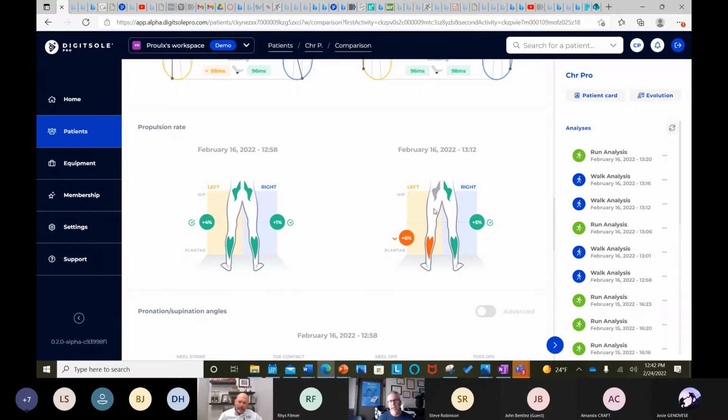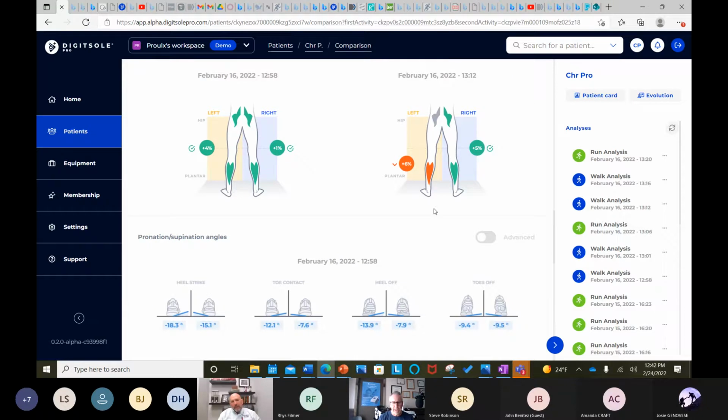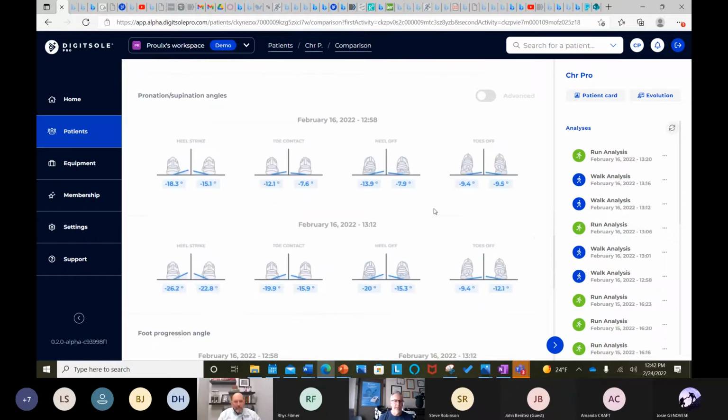But you can look at this particular patient and just look at the arch height on the left is much higher than the arch height on the right. So now we actually have an asymmetry in their supination, pronation, or inversion, eversion situation. So looking at these differences, and what you see is if you do these comparisons, you'll see it's about 6 degrees off all the way across, right? And again, that's because of that slight deviation or orientation.